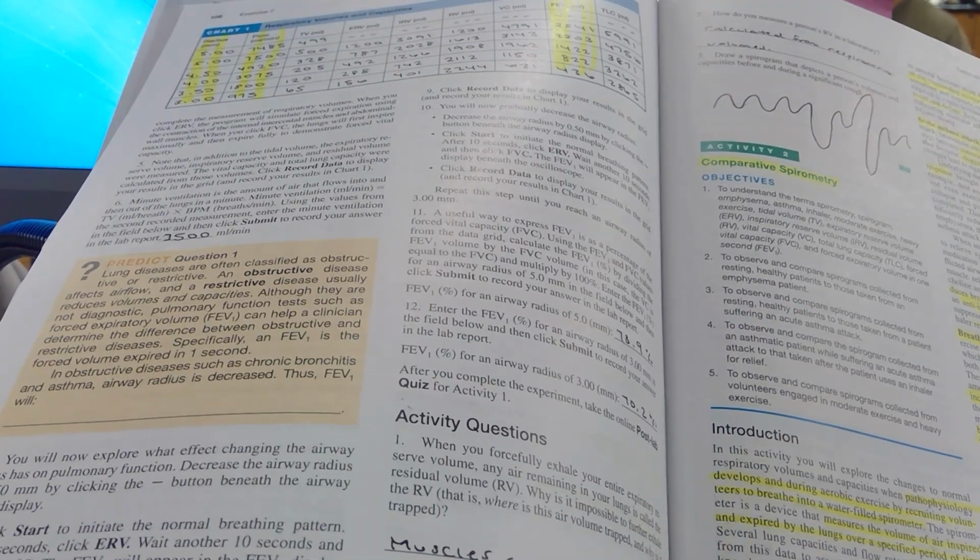In activity 1, we were doing spirometry to measure volumes and capacities, and that's exactly what you're going to do today. On the static spirometers, you're going to find out your tidal volume, your ERV, your IRV, your vital capacity, all of these things.